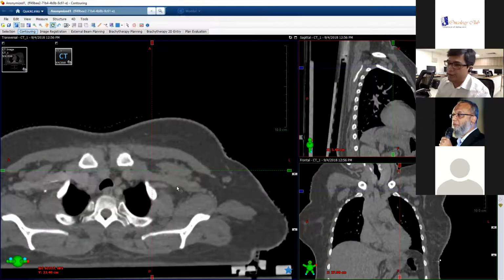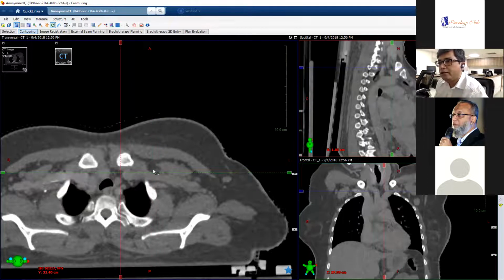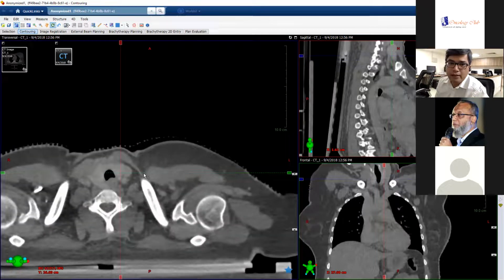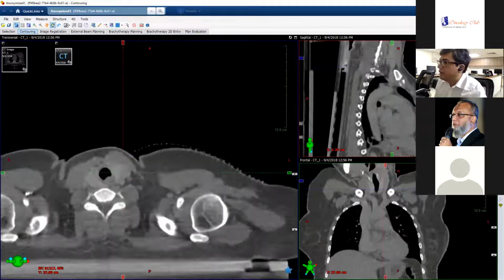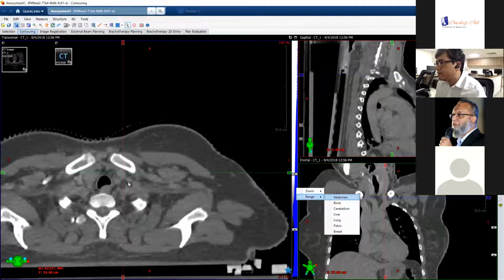So I have a very handy list here, which I've shared with Dr. Tohidul. But let's start with level 4. The easiest way of understanding contouring for the neck levels is by doing level 4 first and going retrograde. The main differences, or rather the main vessels that you need to identify for the boundaries of level 4, are these.